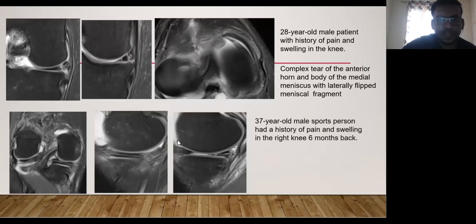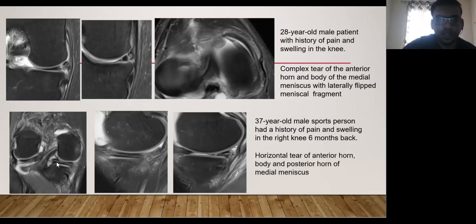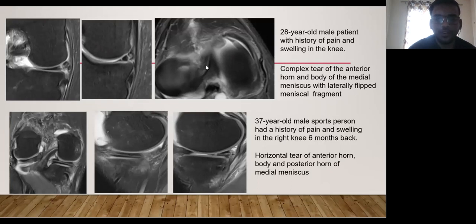A 37-year-old male patient presented with a history of pain and swelling in the knee that had progressively increased prior to the MRI. Here, the MRI shows involvement of the anterior horn, body, and posterior horn of the medial meniscus with a horizontal tear. Horizontal, oblique, and complex tears usually have poor prognosis even after surgery. Small tears are treated conservatively, while large tears usually require partial meniscectomy, especially in young patients who risk developing arthritis at the weight-bearing tibiofemoral joint. Vertical tears extend along the course of the meniscus and have an excellent chance of healing and are good surgical candidates.